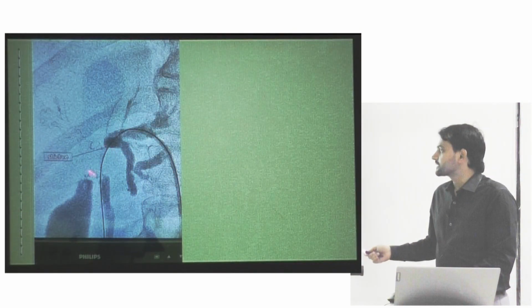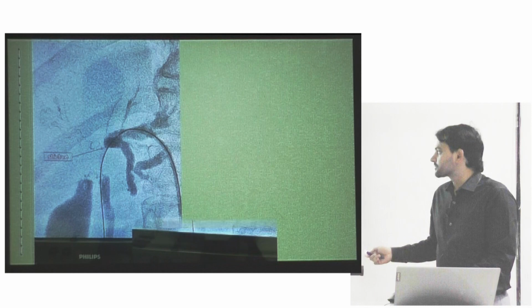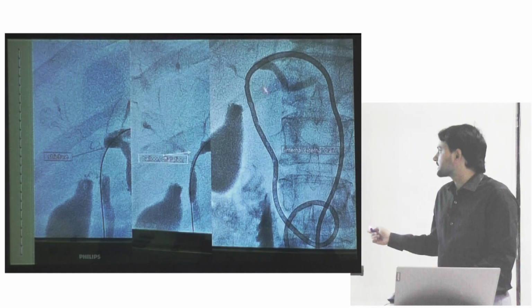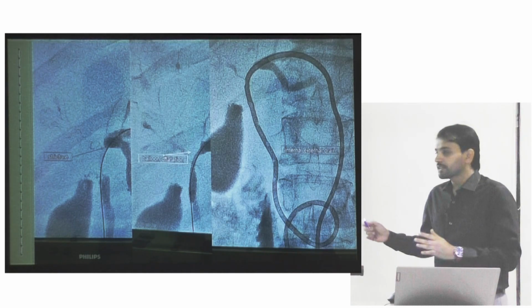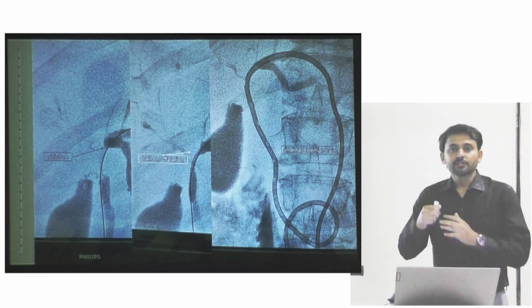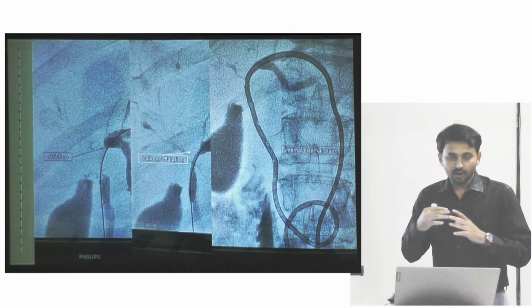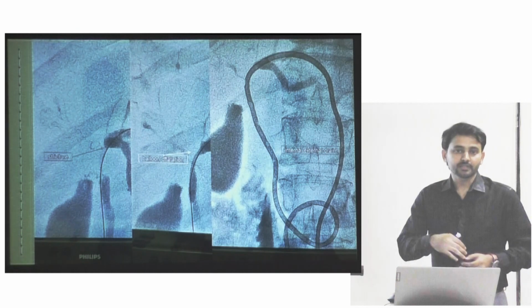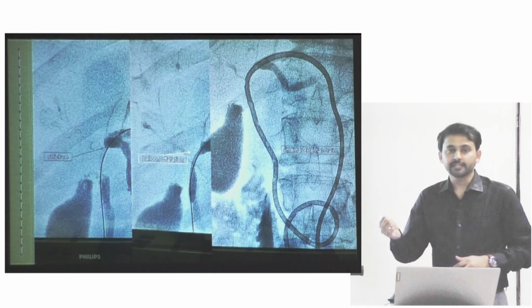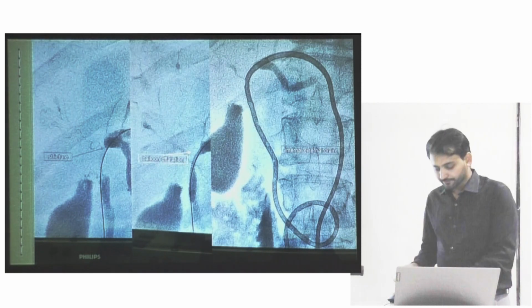So there is a severe stricture, we cross the obstruction, do small balloon dilatation because the catheter is not tracking, and post internal external drain. So the purpose of the internal external drain is to cross the obstruction and to establish the normal pathway of bile flow, that is into the duodenum.